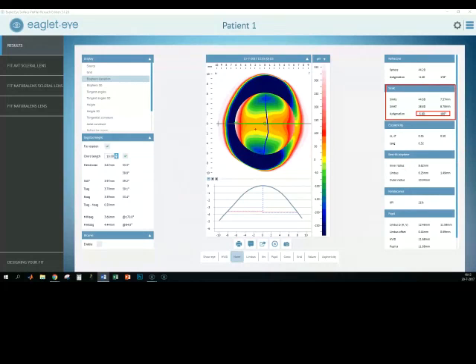So let's have a look and see how it is looking at the sclera, because you see that I took a chord length of 16 millimeters, and I'm going to analyze how the sagittal height is looking. The most important to look at are those two values over here.